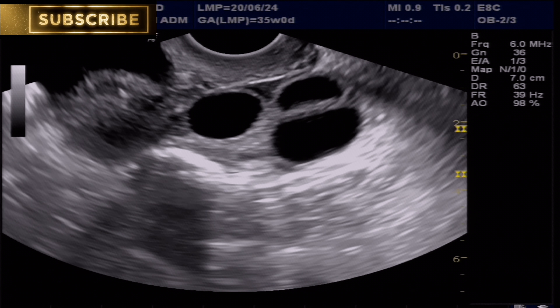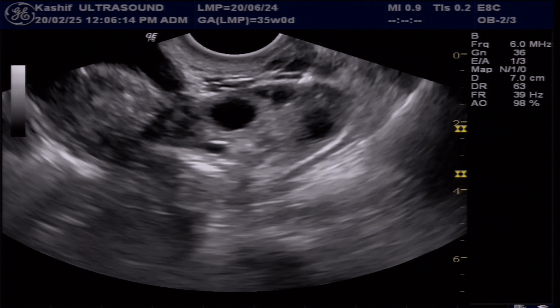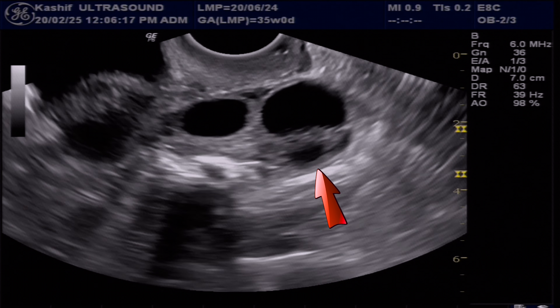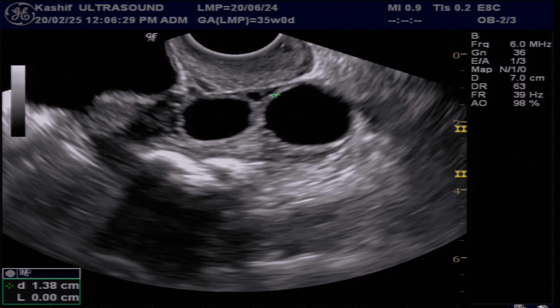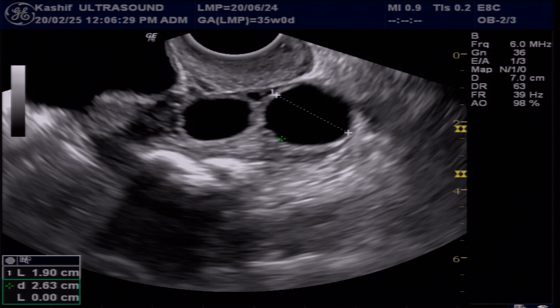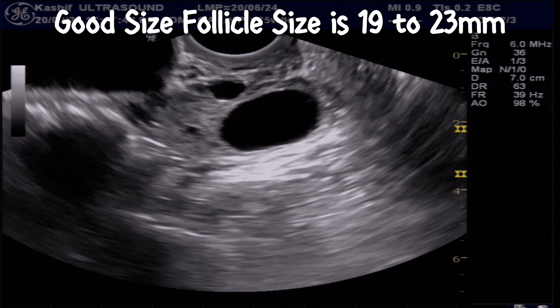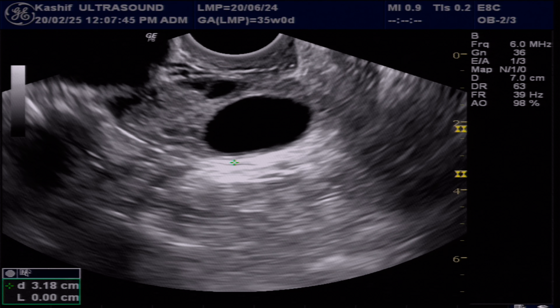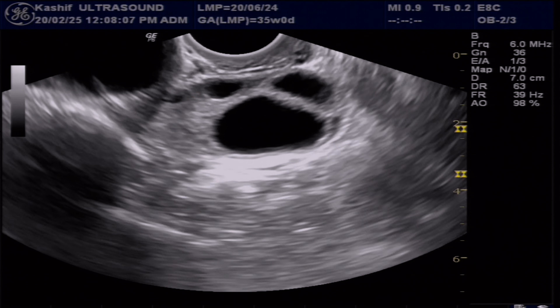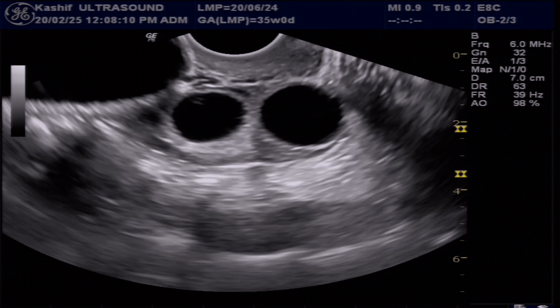Ultrasound is an excellent tool for visualizing the growth and quality of the follicles. A healthy follicle is characterized by a round, thin wall filled with clear fluid, free from internal debris or septa. The ideal size for ovulation is between 19 to 23 mm. Follicles smaller than this size or larger than 28 mm have reduced chances of conception.